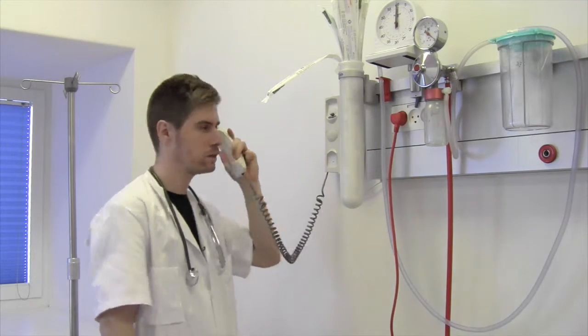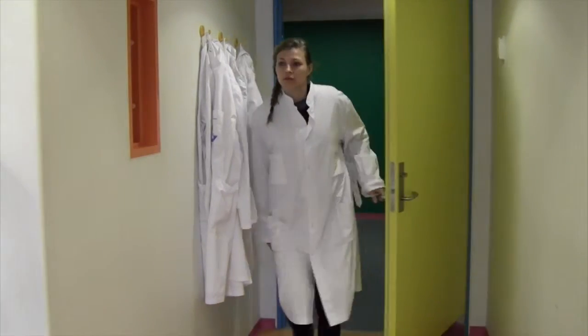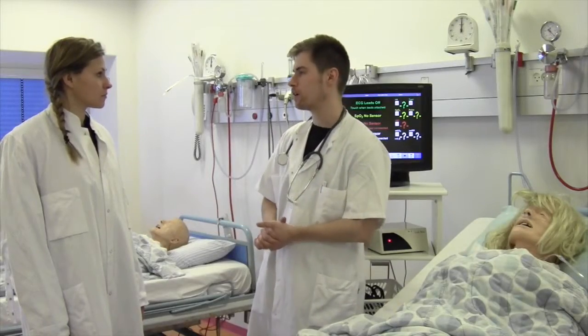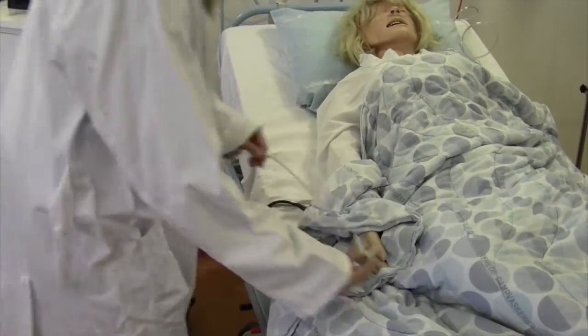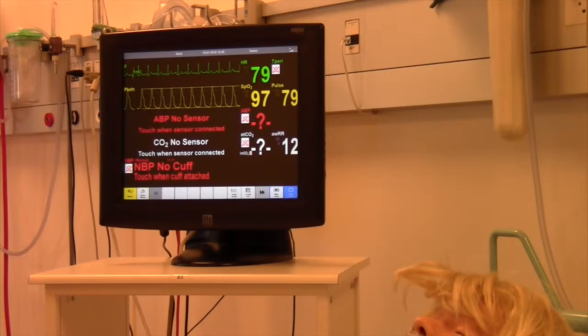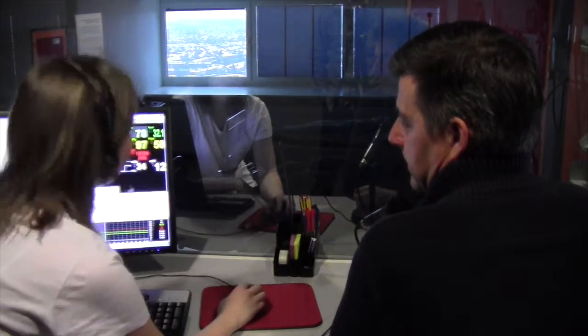Thank you. Hi, could you please put on a pulse oximeter? Yeah. Thank you. Make the patient a bit worse.